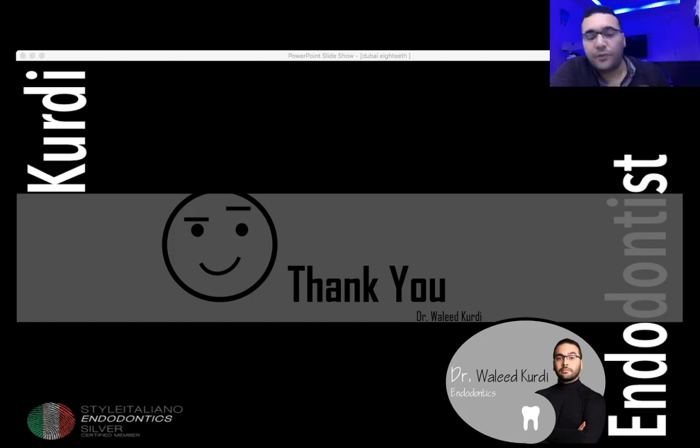But I have to tell you that the best way to retrieve a file is not to break the file from the origin. That's why I'm telling you guys that I don't have a lot of retrieval of my own broken files. More commonly, I have referred cases of broken or separated files, because single use will be great, and thanks God we have a lot of great files nowadays, which are not very expensive and very great in cutting and flexibility, like the Fanta AFF1 Blue file.